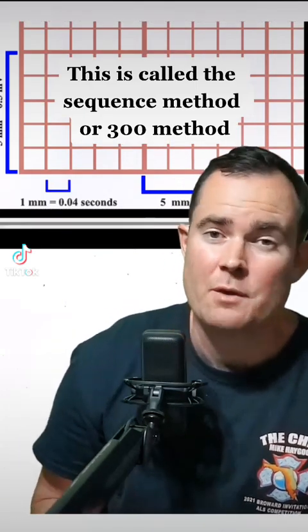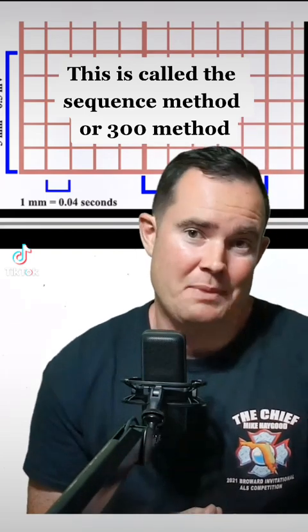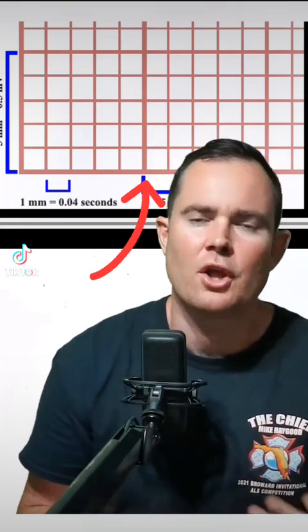So now the first thing I want you to know is how EKG paper is designed. Now there are little boxes and then there's large boxes. So if you take a look at this EKG paper above me, we have 5 small boxes within 1 large box. Okay, now whenever we're trying to determine rate or speed of that heart rate, I want you to pay attention to the large boxes.